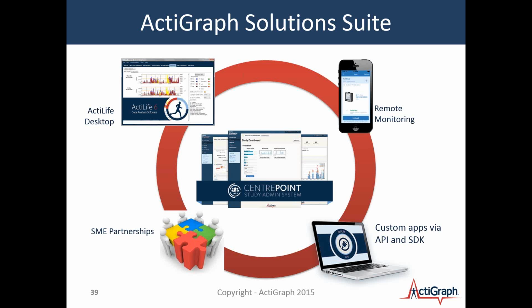But you may be asking about data transmissions of our device from the device itself up through to the study admin portal or CentrePoint portal. That technology uses Bluetooth low energy, and it is a very safe technology. In fact, a lot of intensive care units or hospitals or hospital settings use Bluetooth to connect devices to each other.